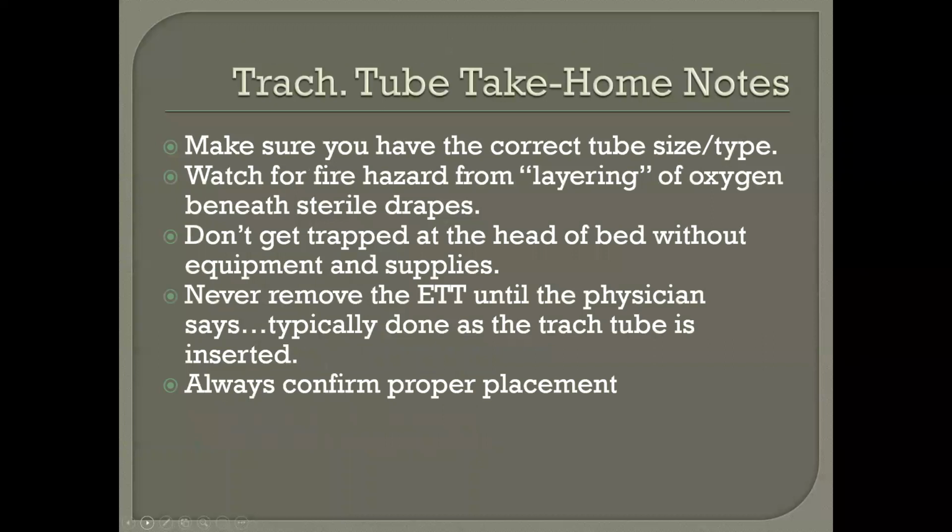Take home notes for tracheostomy tubes and assisting with the placement. Make sure you have the correct tube size, one size down. Watch for the fire hazard from layering of oxygen beneath the sterile drapes. One of the ironies is you're typically putting the patient on 100% oxygen.